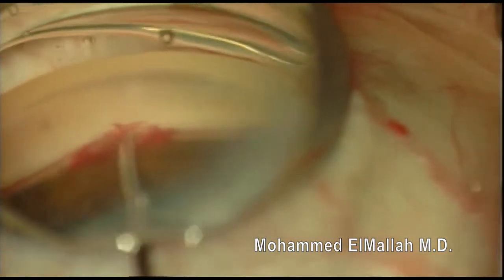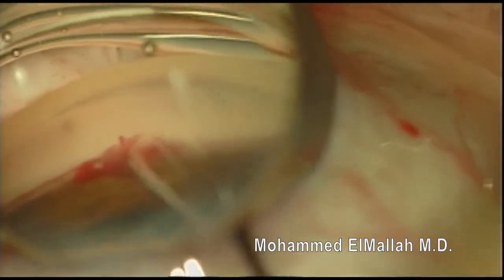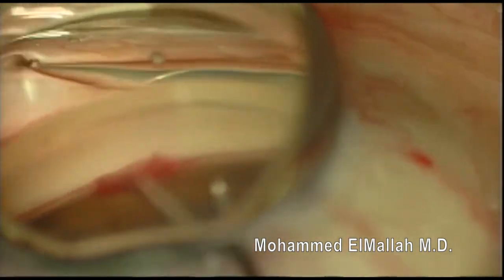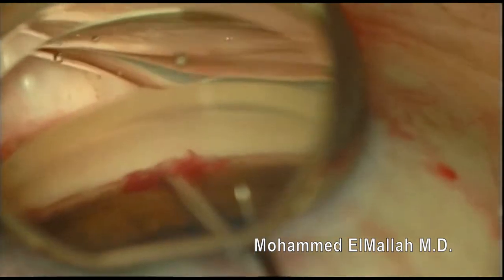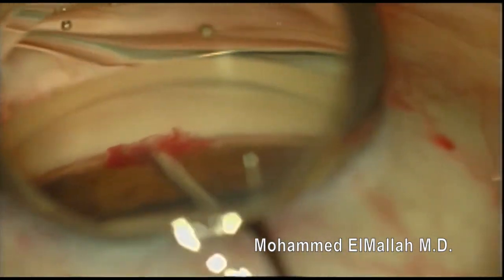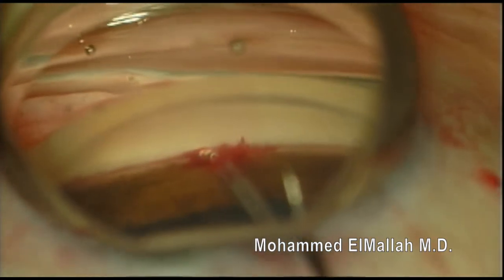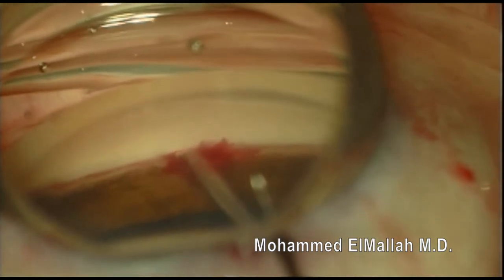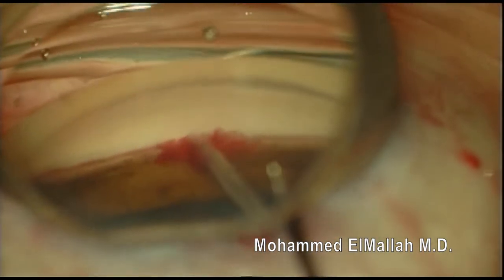Here I still have a moderately good view and I attempt to reinsert. However, you can see that the eyeball is torquing. This means that I am running up against the outer wall of Schlem's canal — I'm in too deep or going in at too steep an angle. I release, and I can tell I'm not happy with the position. I try to push it in a little bit, but it's just not seating properly.